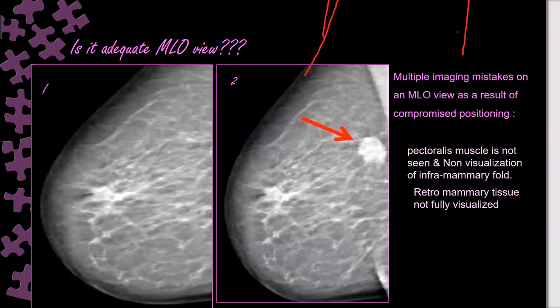It was very suboptimal, unreadable. I just put the probe on the cancer. I repeated a mammogram for her. It was very clear cancer. I don't know why we commit ourselves to report something like this. Even when done properly, we might miss some percentage of breast cancers, it still can be missed. But by ignoring quality, we can miss a lot.